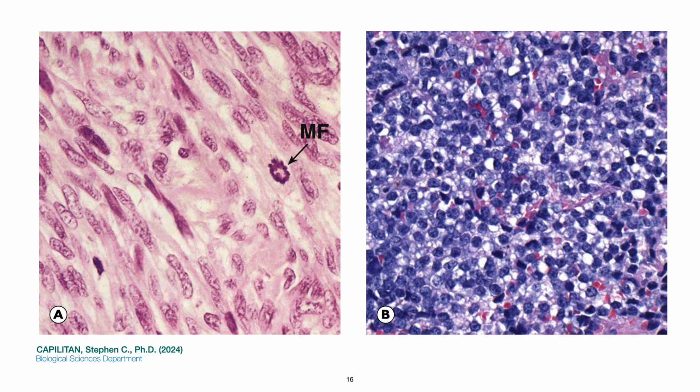and ground substance. Letter A shows an example of a uterine leiomyosarcoma, which is a sarcoma derived from smooth muscle. These tumor cells are spindle-shaped, as you've seen, and resemble a normal smooth muscle cell.